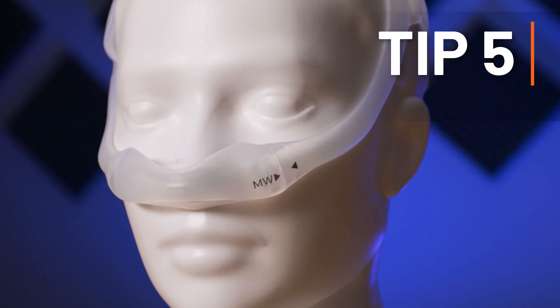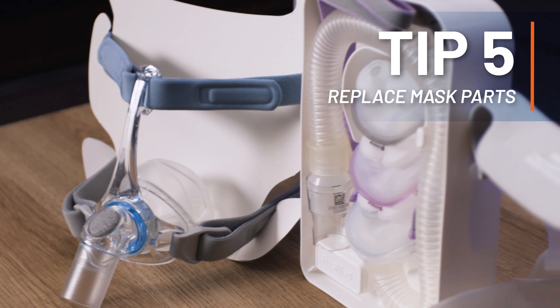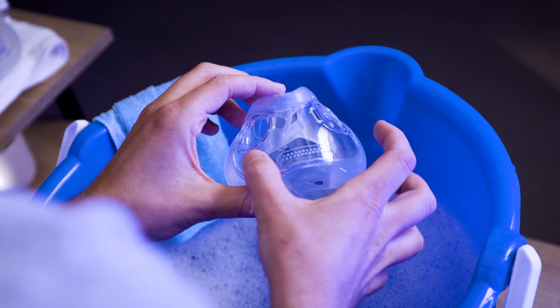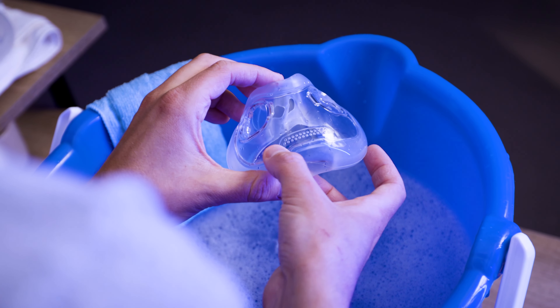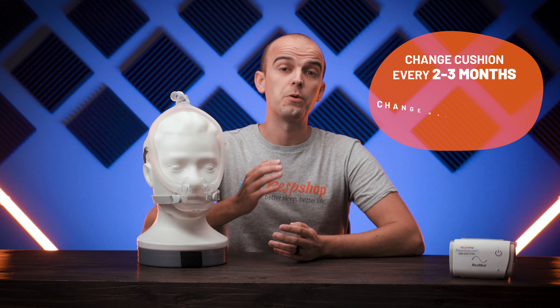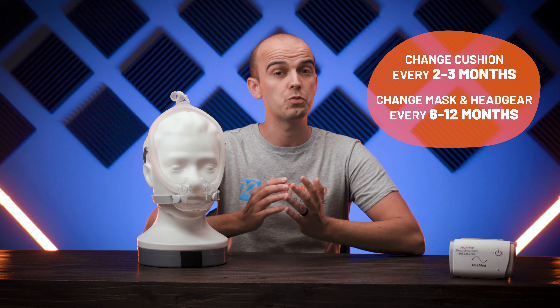Number five is especially important if you have a mask that used to be fine but has now started to regularly leak. In that case, it is probably because some parts of the mask need to be replaced. Over time, cushions degrade, masks develop cracks, and headgear loses its tension — all of these result in leaks. At respshop.com we recommend changing your cushion every two to three months and your mask and headgear every six to twelve months to ensure the seal stays strong.